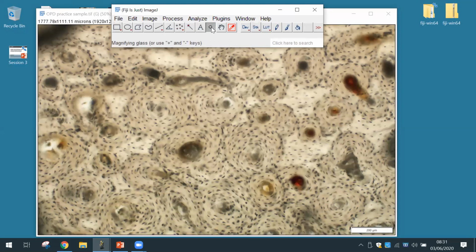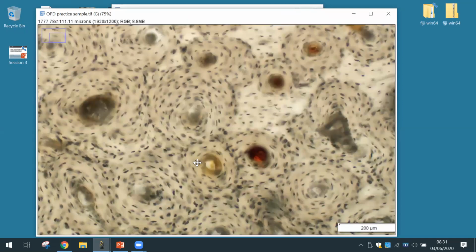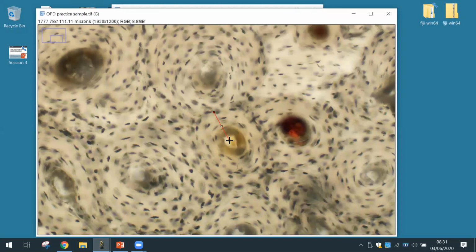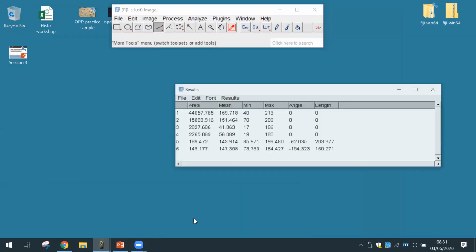And if you have a lot of osteons that are a bit more elongated, or they're not as circular, you may want to report the maximum and the minimum diameter. Ideally you'll go through the center of the Haversian canal as well, to find what the maximum diameter is, and then what the minimum diameter is. So I've just done that and pressed M. And so here's my data.